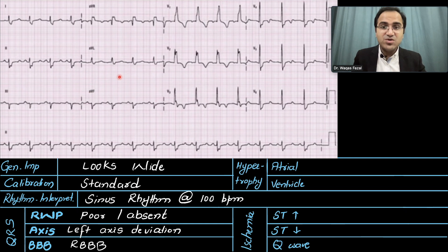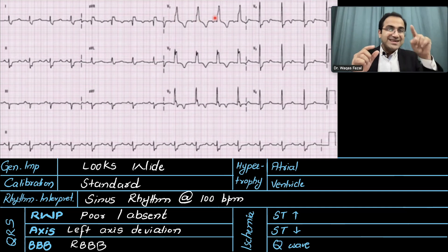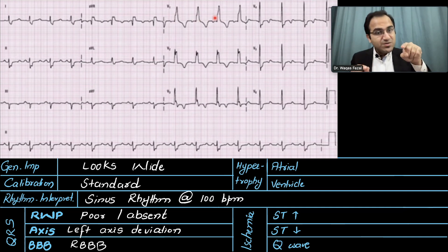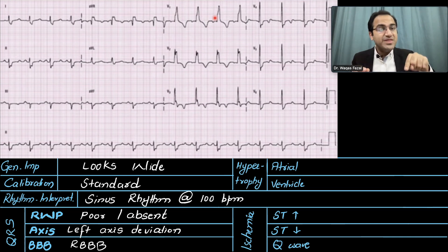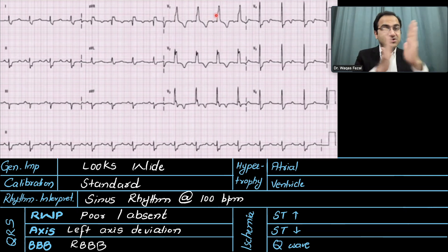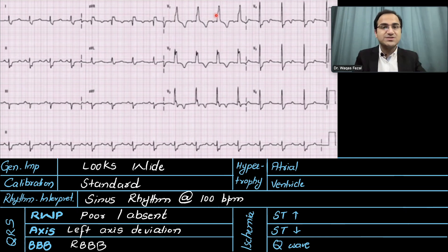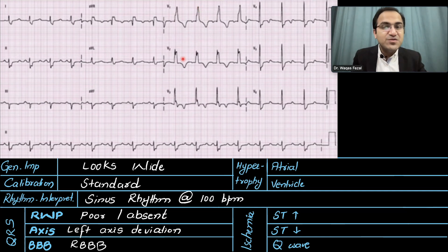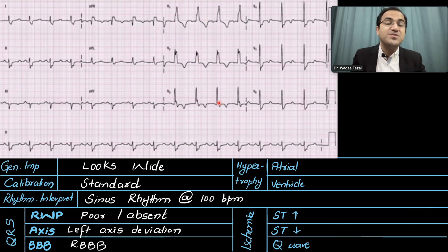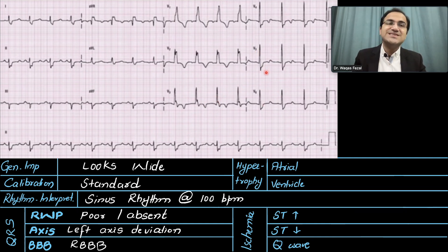Now let's look at the bundle branch blocks. Looking at V1, you might not see the classical M wave — but sometimes the M wave can present as a small notch on the QRS complex. That small notch indicates a combination of two QRS complexes. This small notch is present in the QRS complex here, and you can appreciate it better in V2 and V3, where you can see the combination of two QRS complexes. In V5 and V6 we have slurring of the S wave, confirming right bundle branch block.